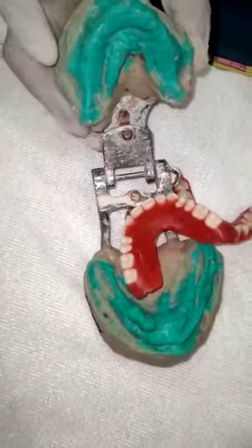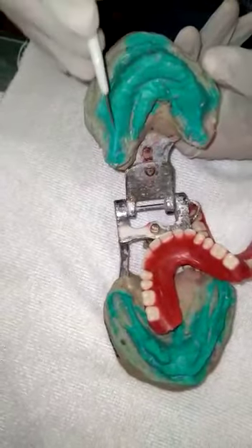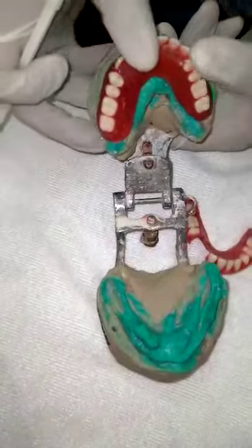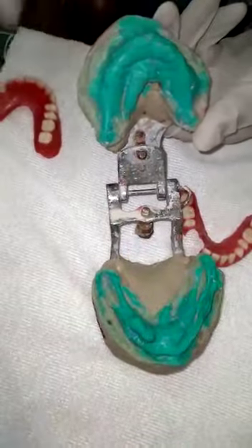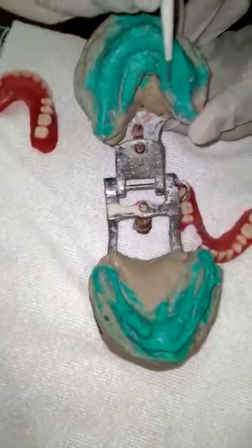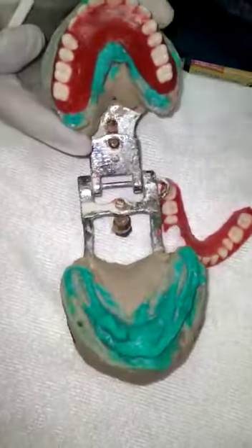This area they have not recorded — the ridge was only recorded. So we have kept the denture coverage only up to the impression area, up to the ridge, since they were not having the palate recorded.